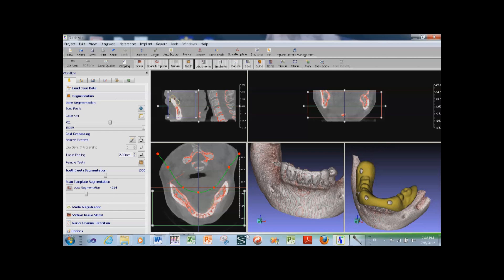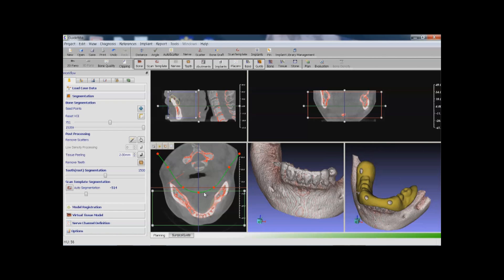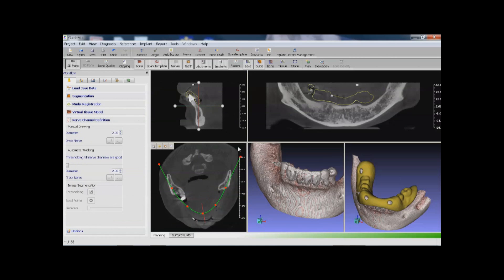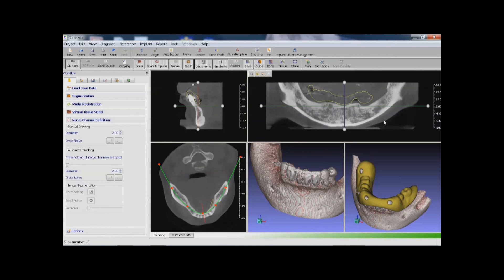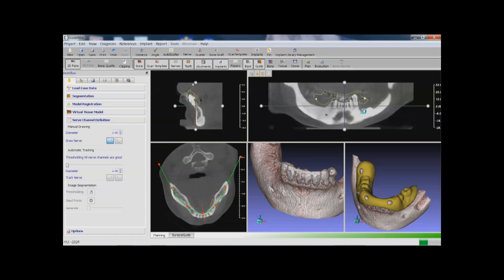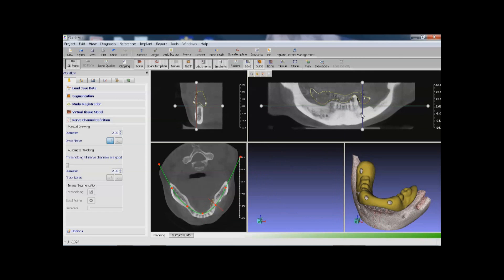Then we want to track the nerve channels. First, we adjust the arch curve by moving the curve or the handles. You can also add or delete handles. Now we enter the channel tool, scroll the slice view, identify the entry point, start placing points, then change slices and add more points.